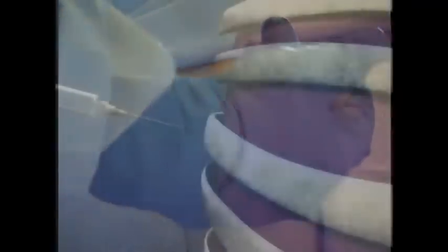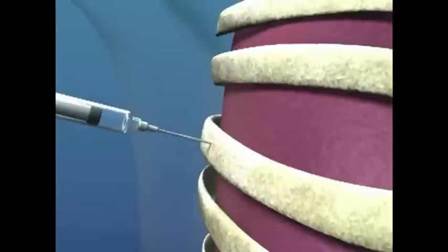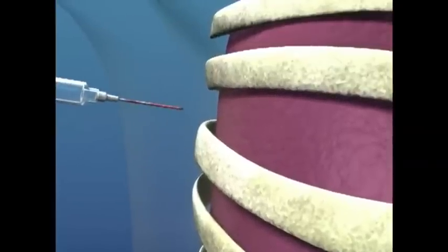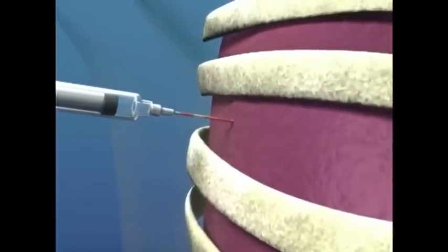Using a small gauge needle, locally anesthetize the skin and subcutaneous tissue and the periosteum of the underlying rib. If possible, the pleura just past the rib should also be anesthetized.